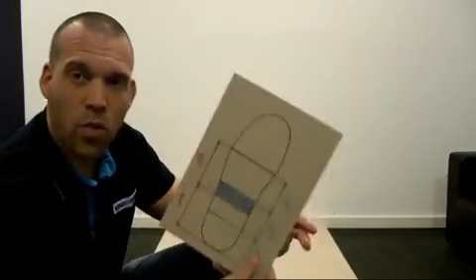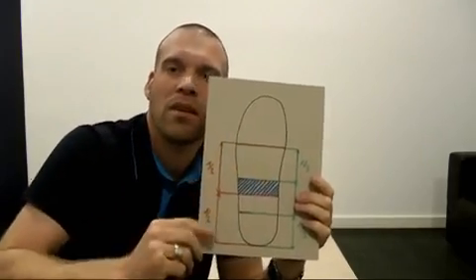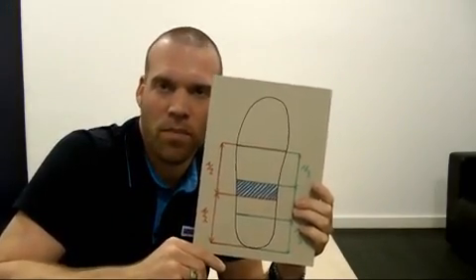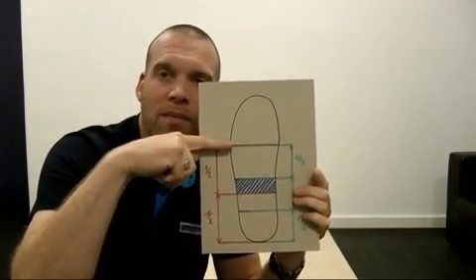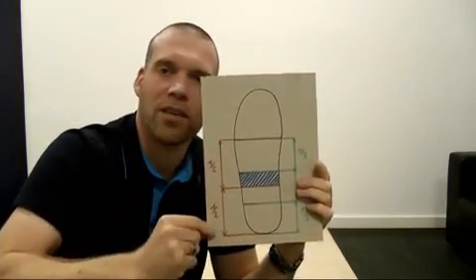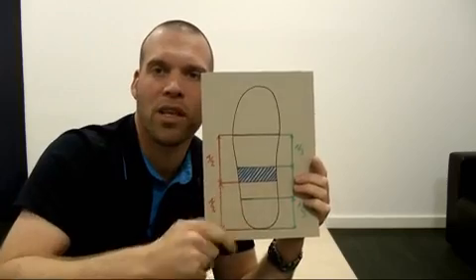To explain this, we took out the insole of the shoe and traced it on this cardboard as an example and then made some drawings on it. On this sole, we marked the highest point of the roll-off line and the end of the heel. We marked here in red and divided the available supporting area into halves.